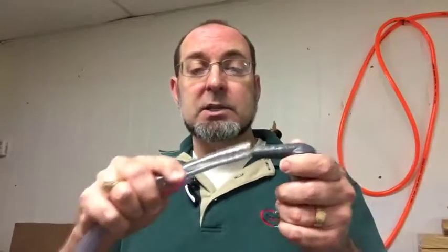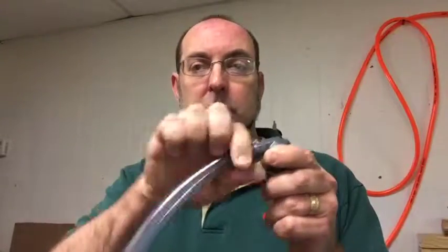And that stuff is a little more flexible, and it's easier to shove onto this thing. You just wet it, or worst case, just use a little bit of surgical lube and get that on there, and then go ahead and put a hose clamp on it, and you should be in good shape.